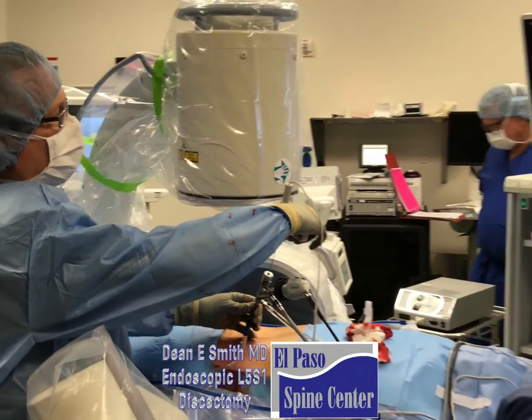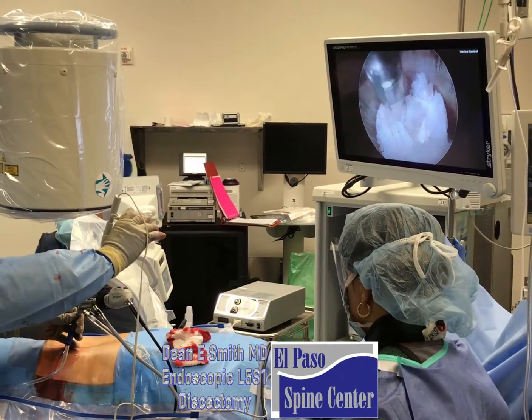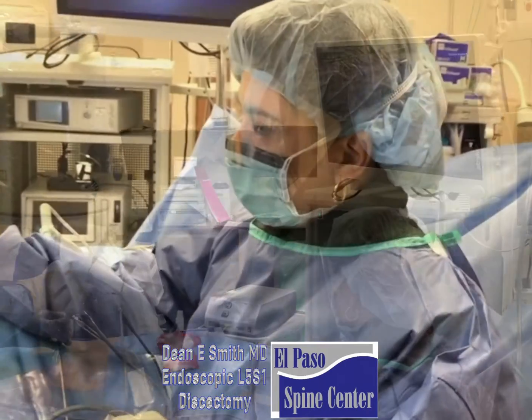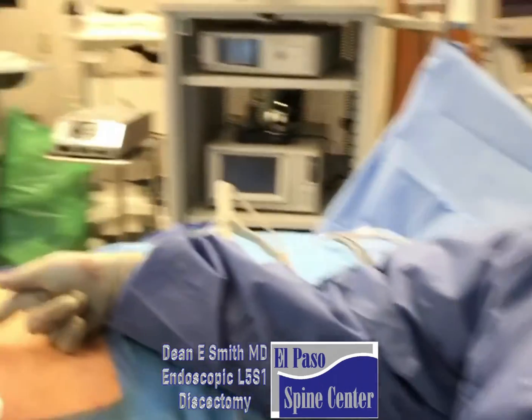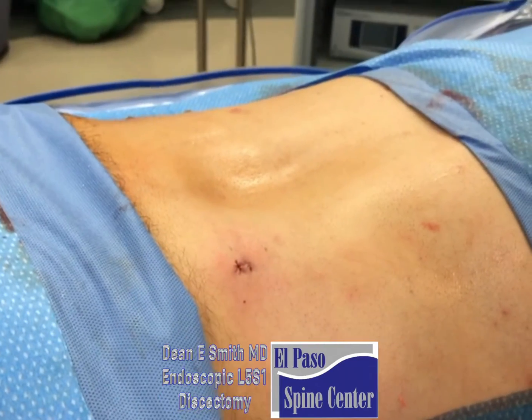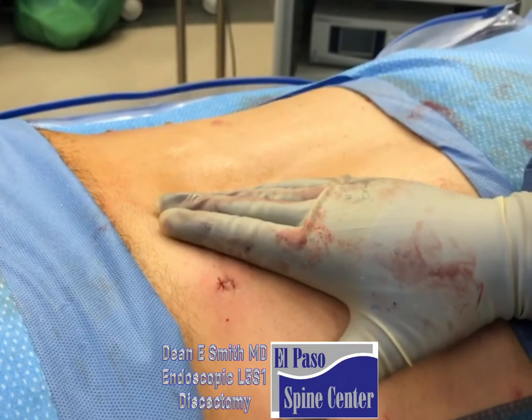If we get some bleeding, we can also stop the bleeding using this. Can you show them the incision associated with an endoscopic discectomy? Can you put your hand up next to that so we can see how big it is?